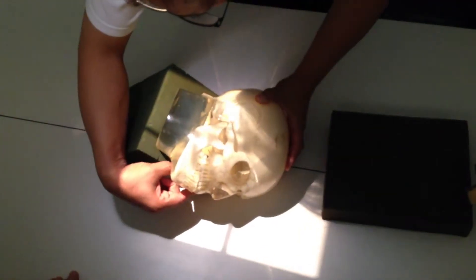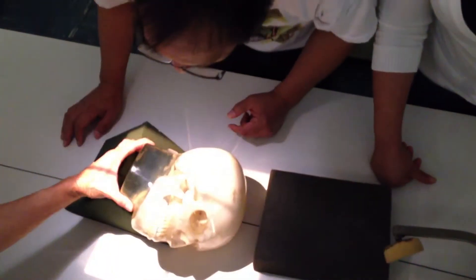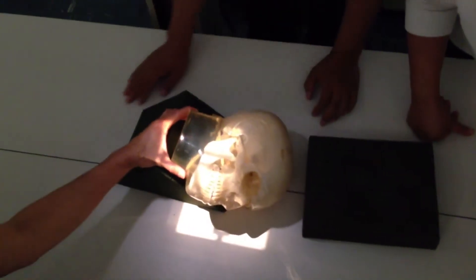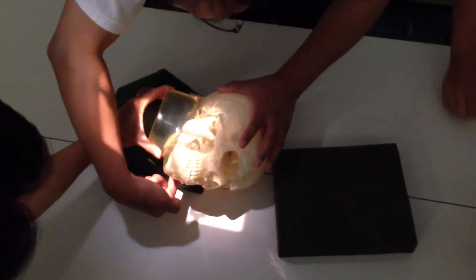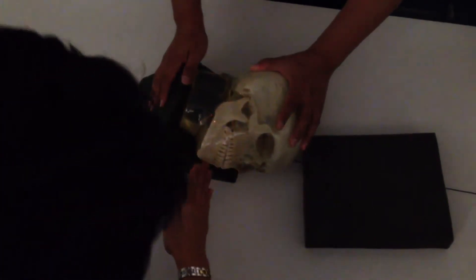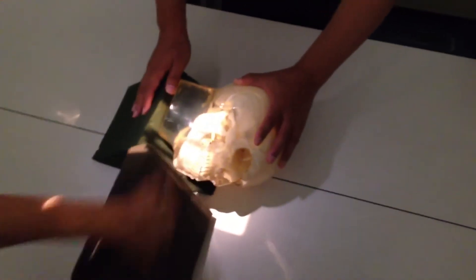For the mandible, I want to make sure that the exit — the bottom one — is exiting here, like about that. That's where it should be. The bottom one is there, and I'll put my marker here, but I don't have all the skull. I know I have to put it on the bottom one — you're going for the bottom one. But I have to angle also. Don't do too much, because then you're going to start turning the body. The body is flat, and then you're going to start distorting it so they can't see the body.